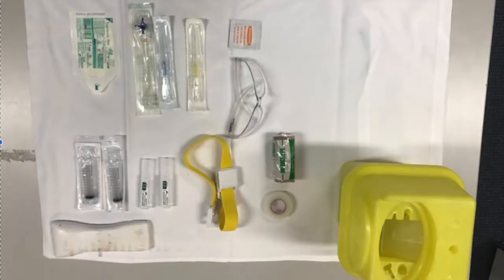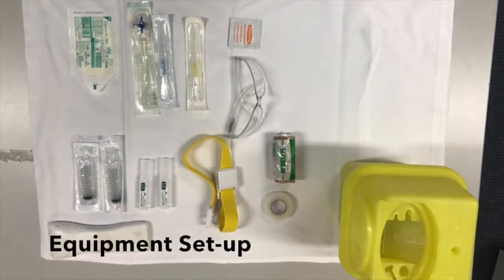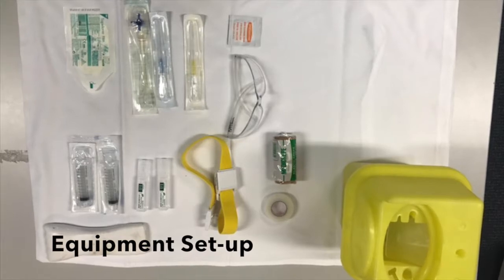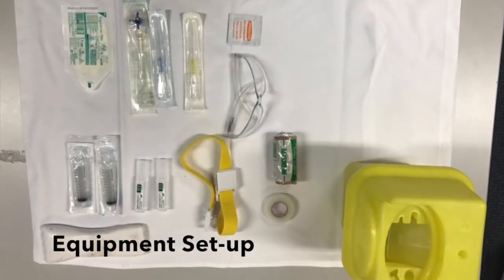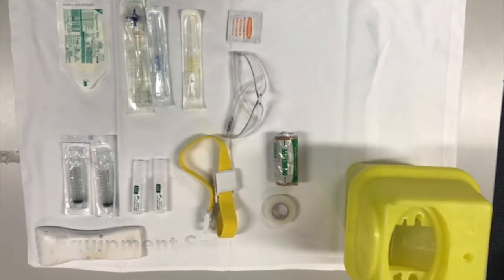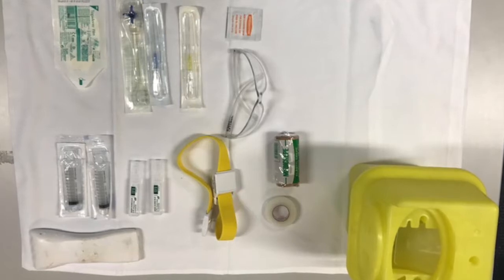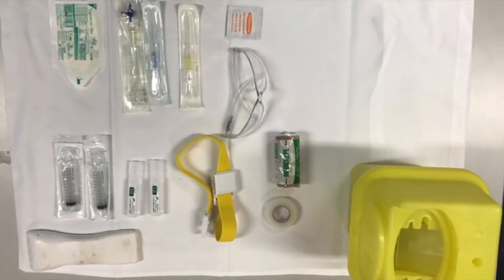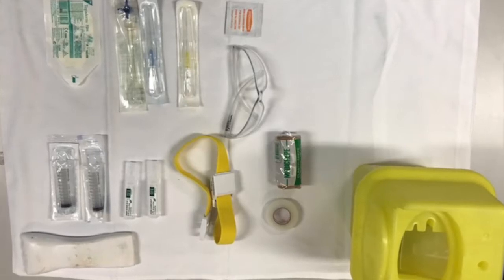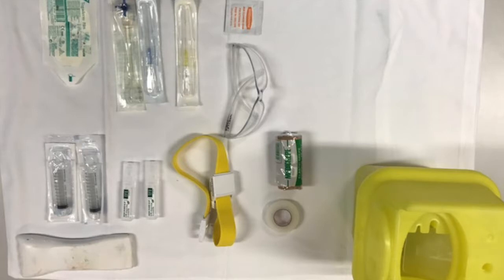As per any procedure, I've set up my equipment prior to doing the procedure. Here I've got my tourniquet, my tegaderm, my 3-way tap, extension tap, my 2 cannulas, size 22 and size 24 gauge, which are utilised for pediatrics, alcohol swab, safety goggles, tape, bandaging so that I can wrap the pediatrics cannula up, a little arm board, and a sharps container.